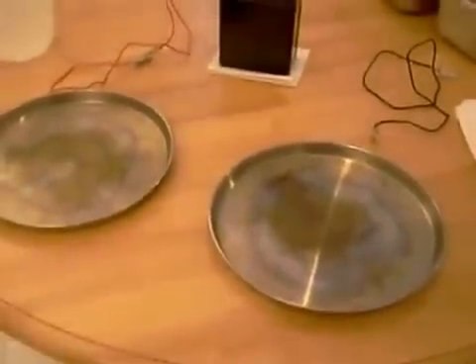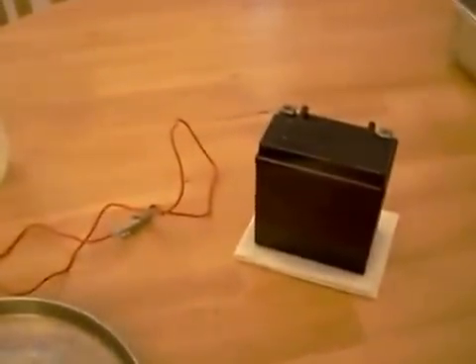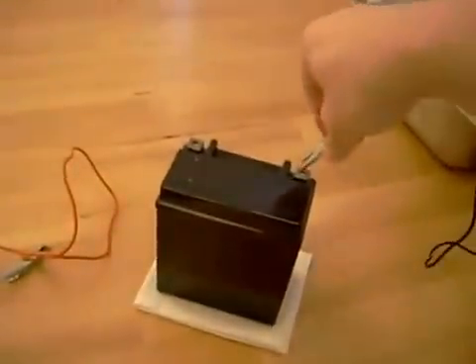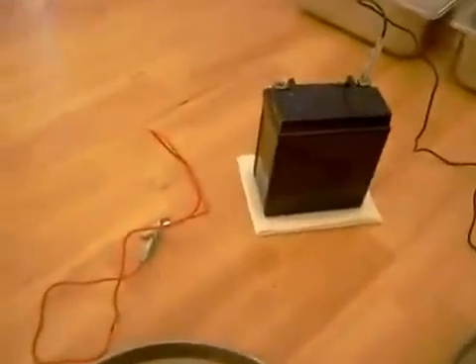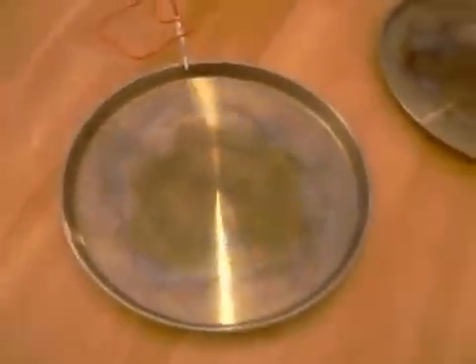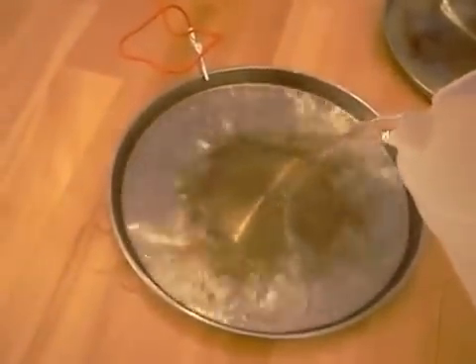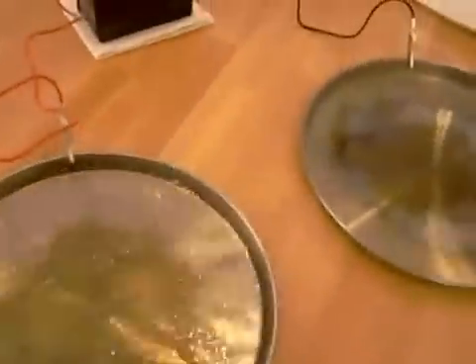This is basically all you need to cure your sweaty hands. What we're going to do first is connect the black alligator clip to this stainless steel pan, just like this. Then we're going to connect the red alligator clip to this stainless steel pan, just like this. And then we're simply going to fill these pans with regular tap water — right out of your faucet will be fine.